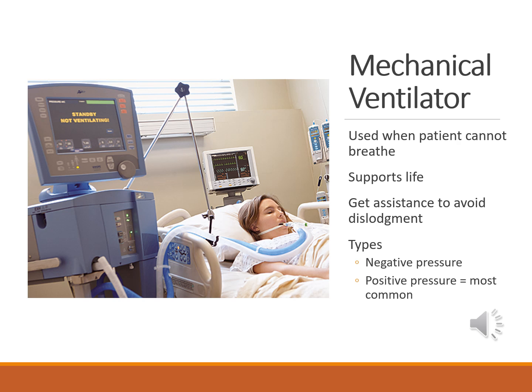In the ICU, radiographers often need to take x-rays of patients on mechanical ventilators. Since these machines are crucial for breathing, it's important to follow all safety measures when handling them. Mechanical ventilators might be needed due to a condition that affects the nerves or muscles involved with breathing, known as extrapulmonary disorders. Alternatively, issues with gas exchange like pulmonary embolism or respiratory distress syndrome can also necessitate mechanical ventilation.